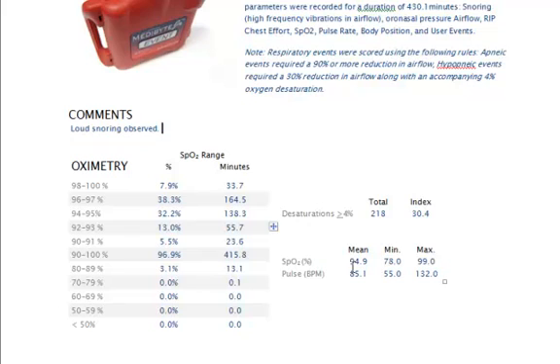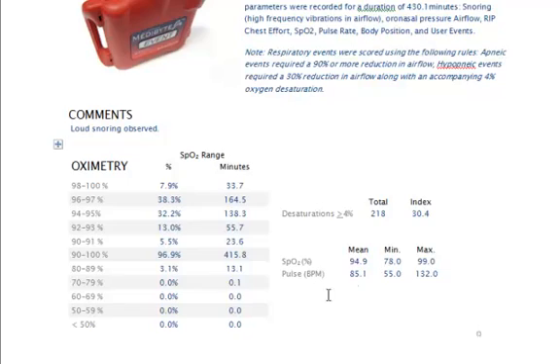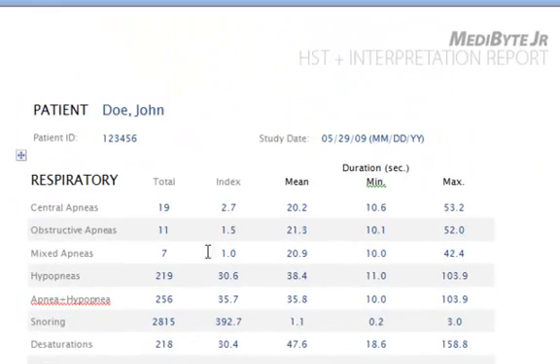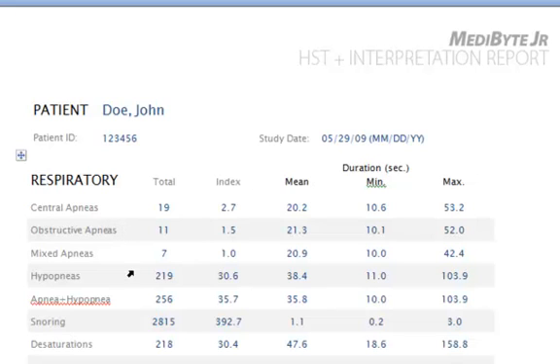Most pulse oximeters are not sufficiently capable of detecting blood oxygenation levels below 50% with reasonable accuracy. On page 2, it's a breakdown of the respiratory events: central apneas, obstructive apneas, mixed apneas, hypopneas, total of apneas plus hypopneas, snoring events, desaturations.